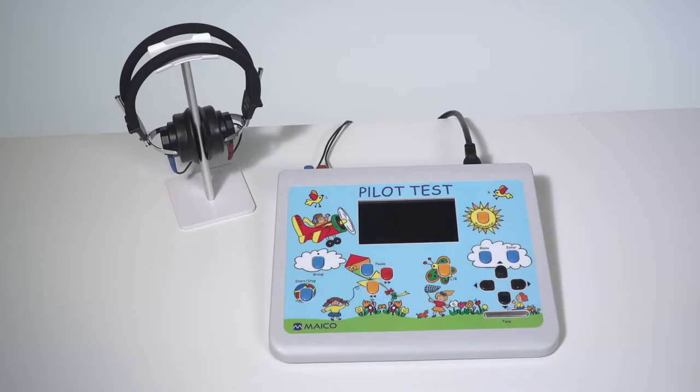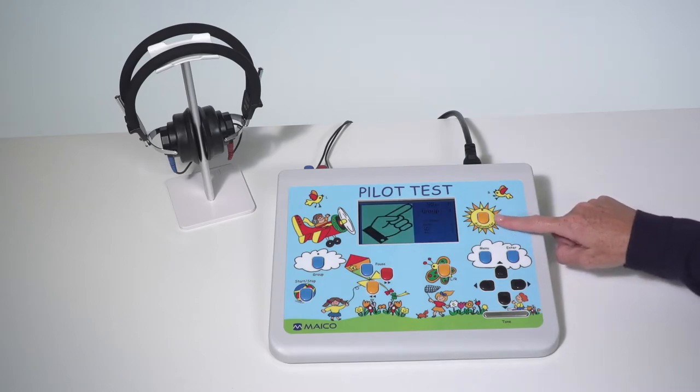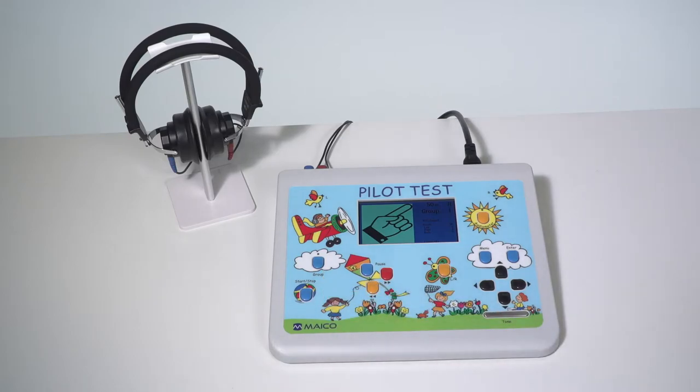To power on the device, flip the power switch on the back of the unit. Select the test by pressing the audiometer button in the sun for pure tone audiometry, or the select picture audiometry test in the cloud. The device is always powered on to the test as selected within the settings.